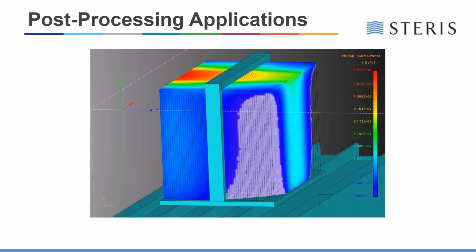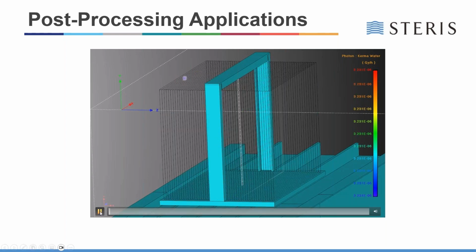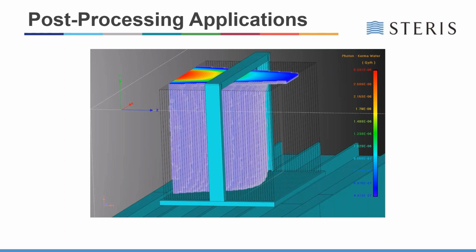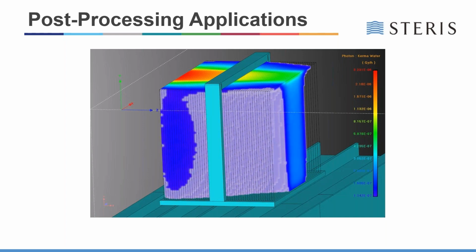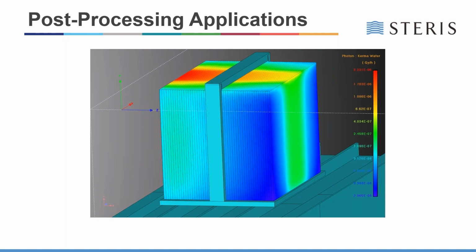As we could see from the video that we just saw, there's a pretty clear note that the dose at the very top, if we review this again, seems to be coming in much, much quicker than the dose at the bottom. Visualization of this distribution is helpful for identifying perhaps changes to the processing routine, or being able to understand dosimeter response and integrate that information into bettering routine processes and the services provided by STERIS.